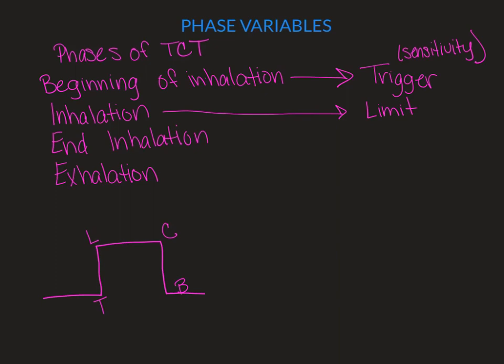So for limit, we are going to set pressure and it will hold it there.